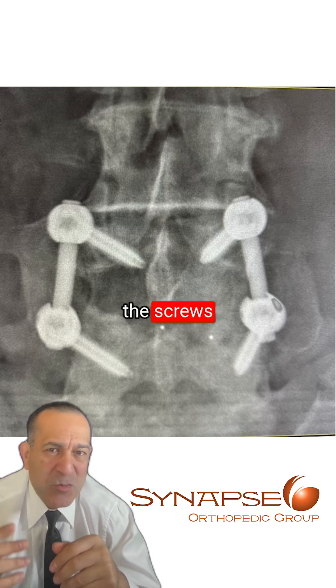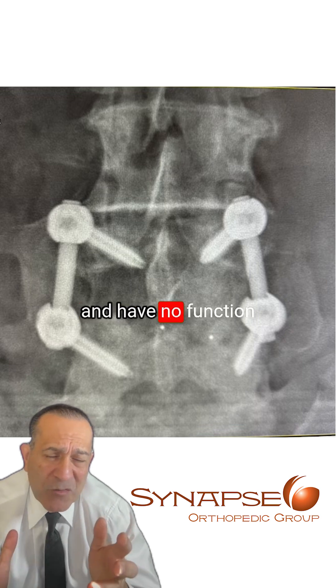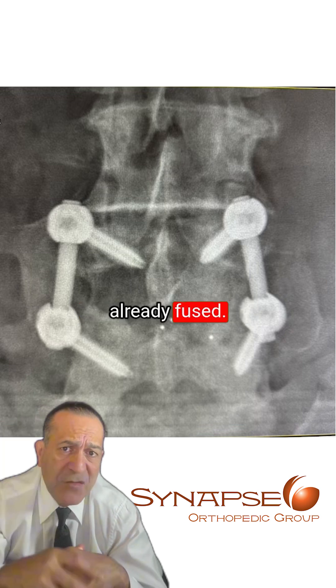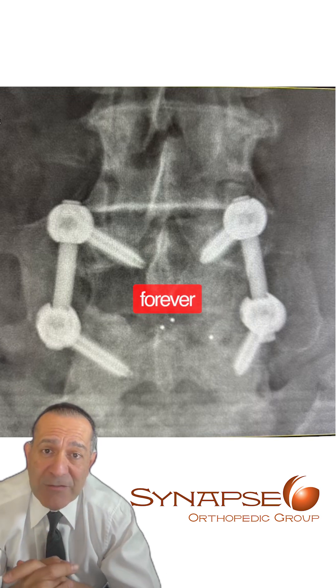At that time, the screws really don't do anything. They're just sitting in the bone and have no function, because the bone has already fused. In most cases, we don't take them out — the screws just stay there forever.